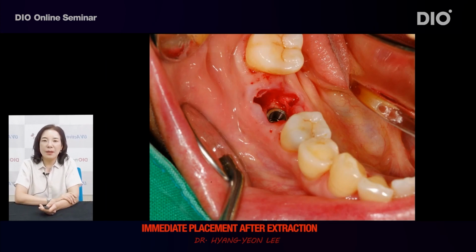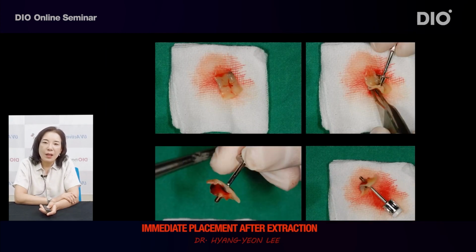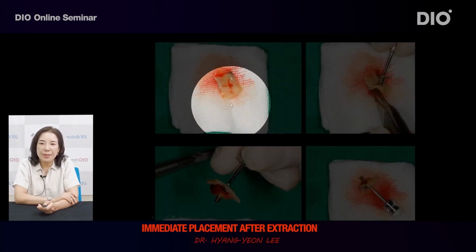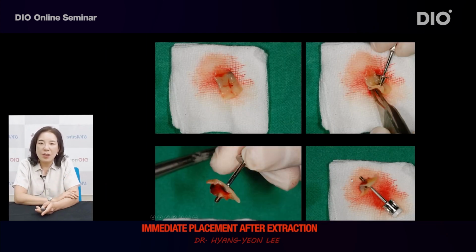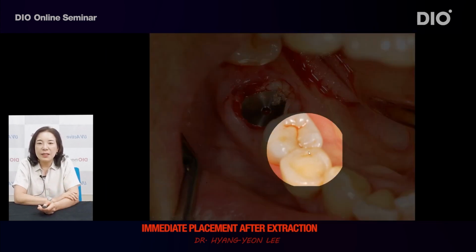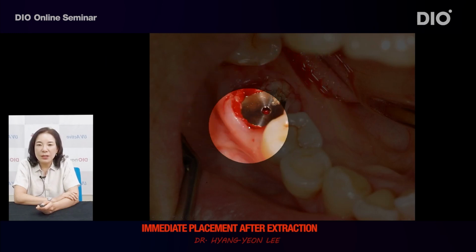It is very useful to use bone-forming screw for molar tooth or large cavity that cannot be covered only with healing abutment. Mount PRF to the bone-forming screw. Make PRF flat like this and place implant by mounting the PRF onto the bone-forming screw. What is important is that this bone-forming screw margin must be inside the tissue.